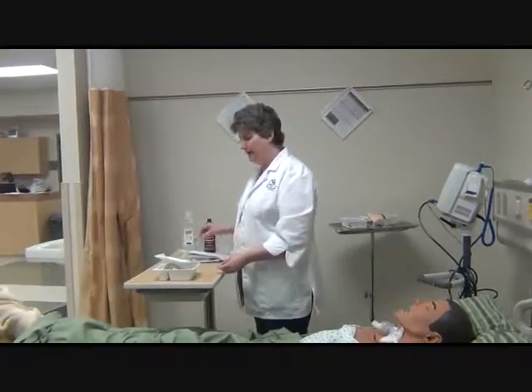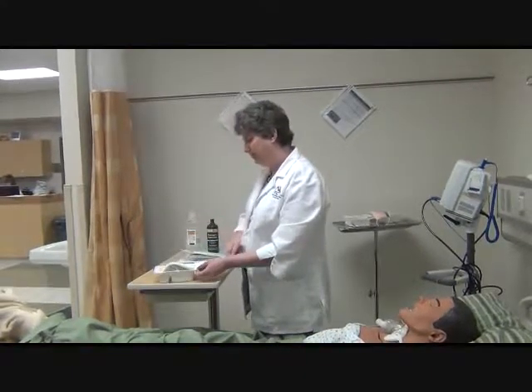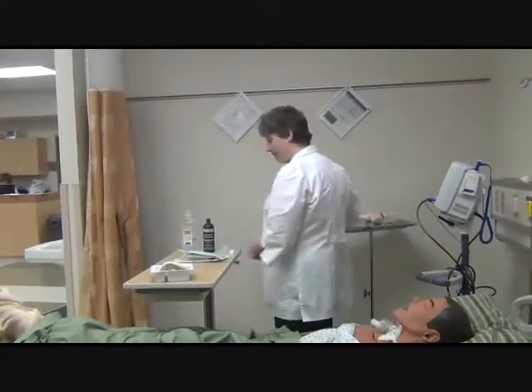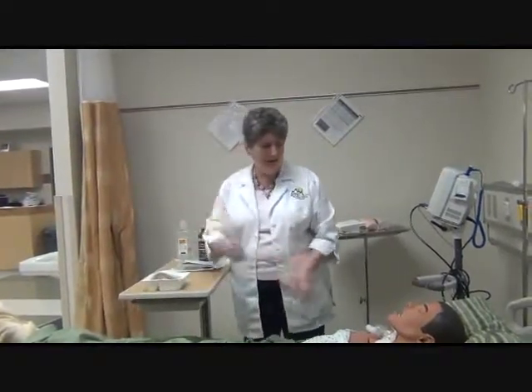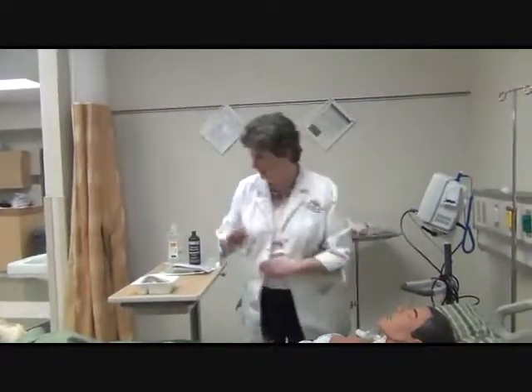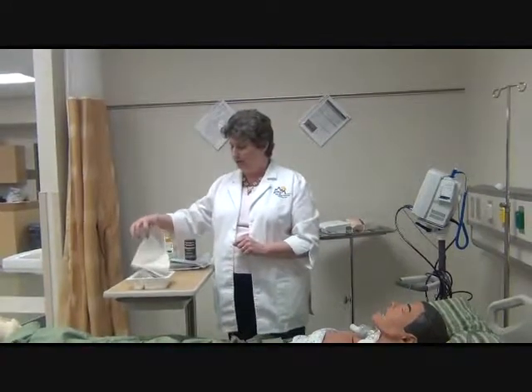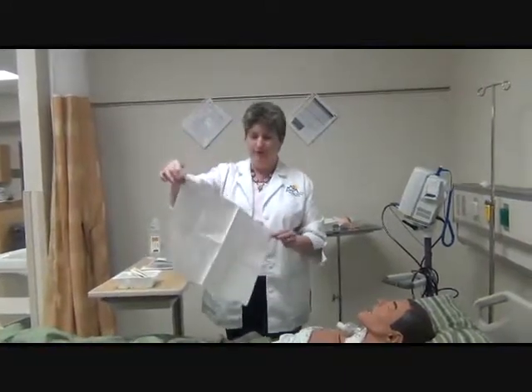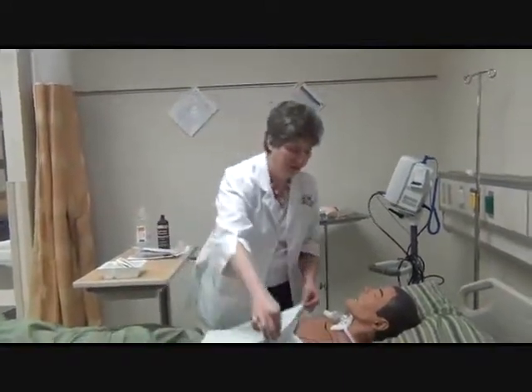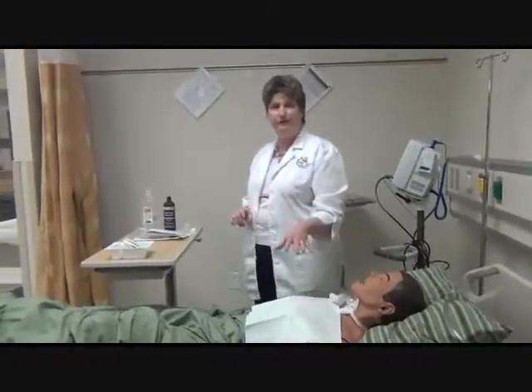Okay. I'm going to open up my trach kit. I'm going to pull that back and get this out of the way. And again, I've got my patient prepared. I have this down. I've explained the procedure. Usually these will come on top, so I'm going to place my drape on the patient and put it up here. That gives me a surface to work on.